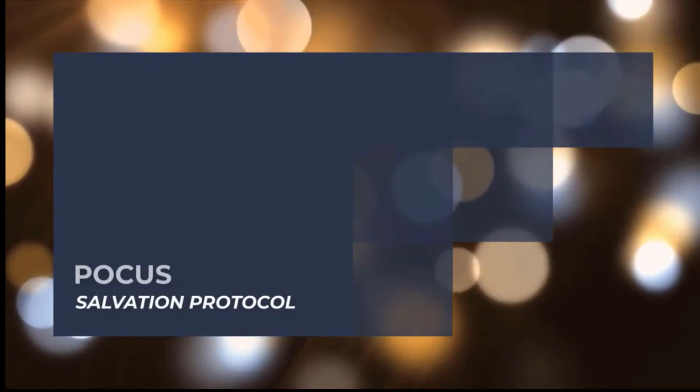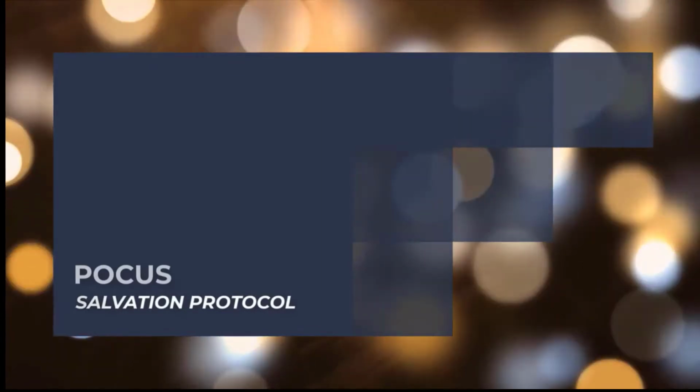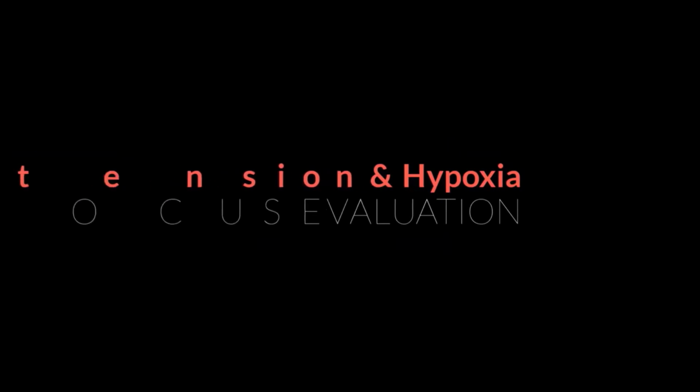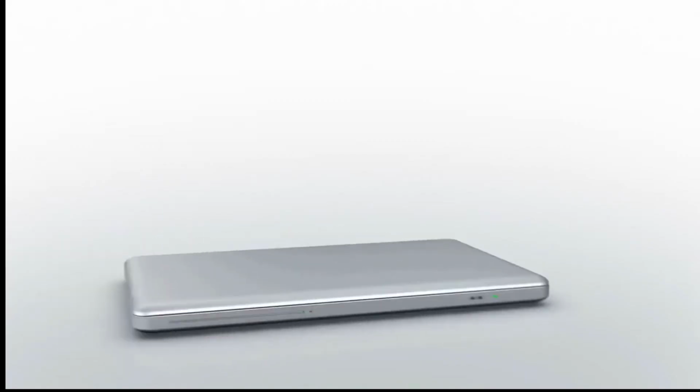Welcome to this tutorial. We will go through the salvation protocol for evaluation of hypotension and hypoxia in the perioperative period. This tutorial is divided into 3 parts. Part 1 of the salvation protocol is presented here. Watch this on a laptop or desktop for a better experience.